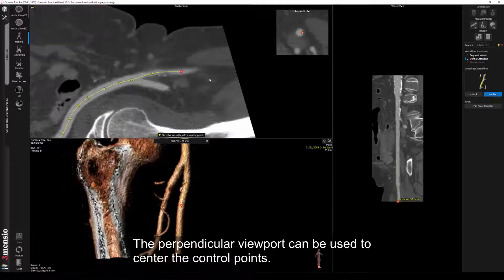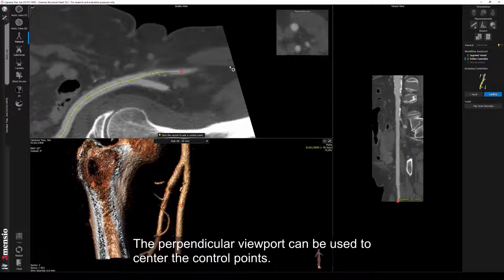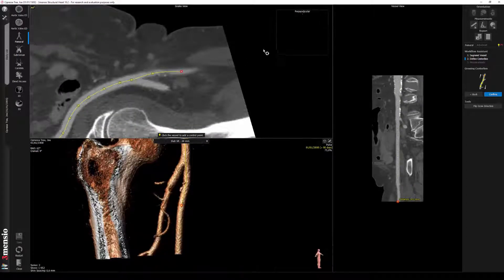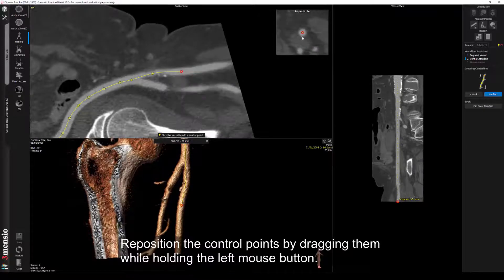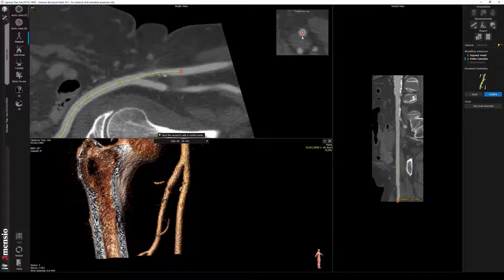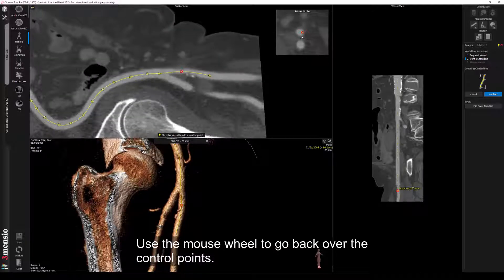The perpendicular viewport can be used to center the control points. Reposition the control points by dragging them while holding the left mouse button. Use the mouse wheel to go back over the control points.